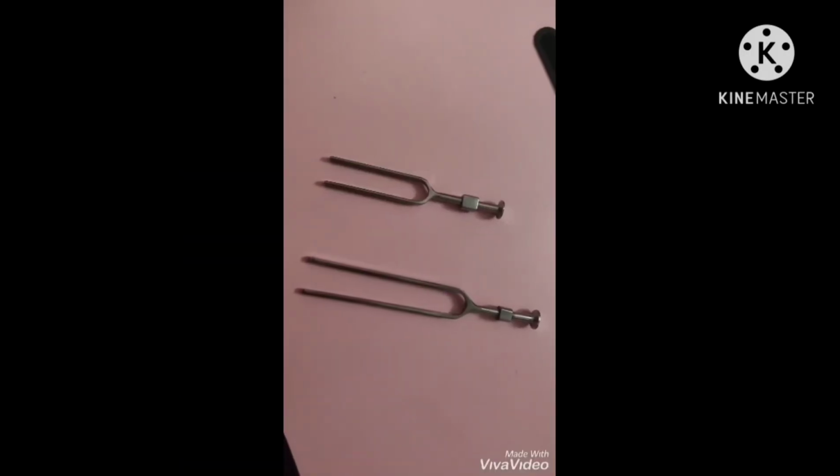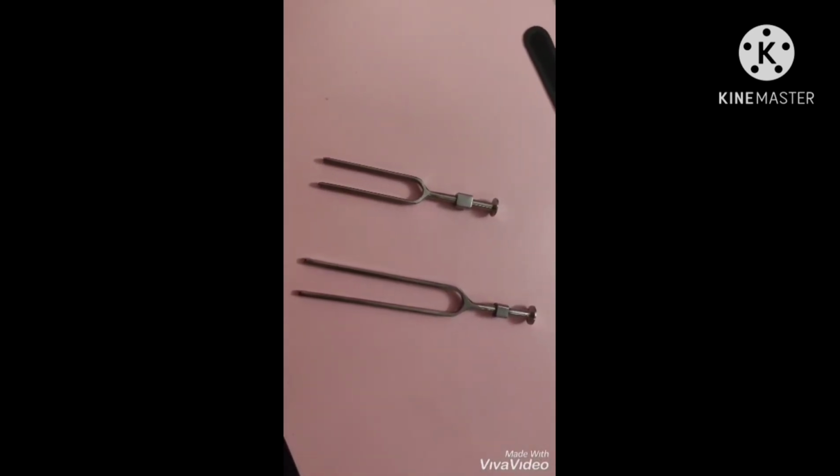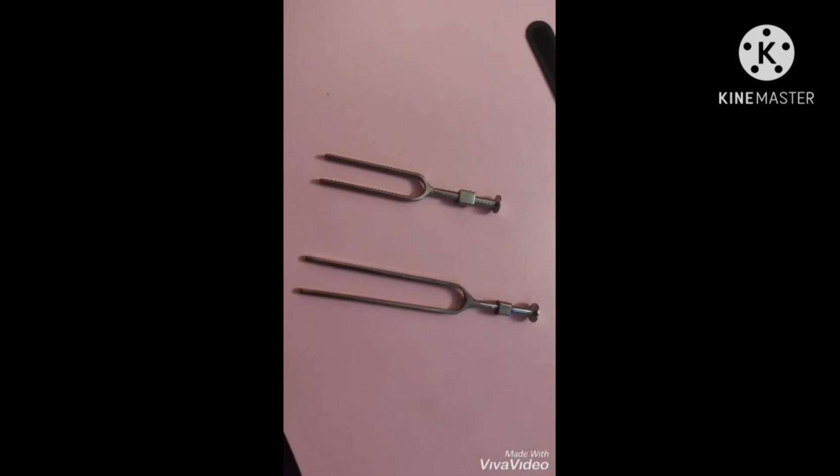For patients failing the whispered voice test, a tuning fork test helps to determine whether the hearing loss is conductive or sensorineural in origin. In a quiet room, select a 256 Hz or 512 Hz tuning fork, as these frequencies fall in the range of conversational speech.